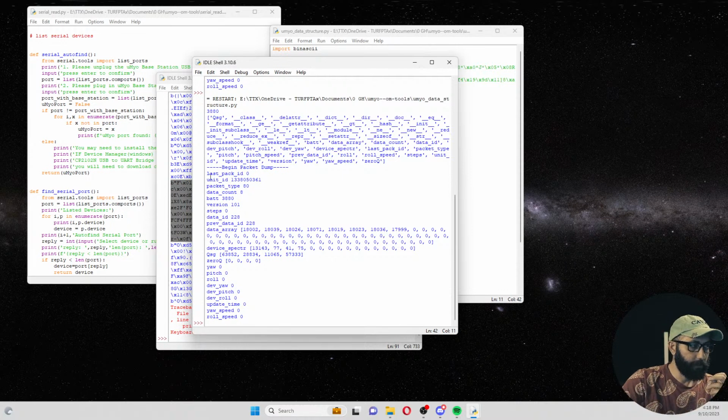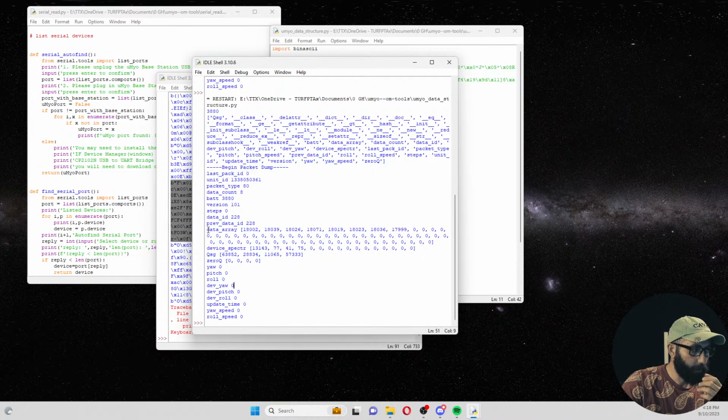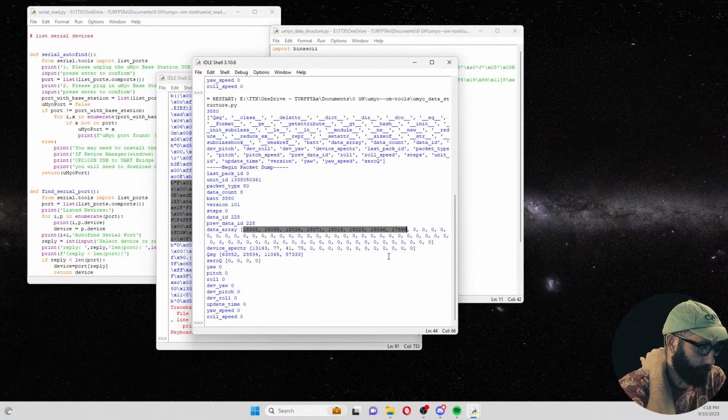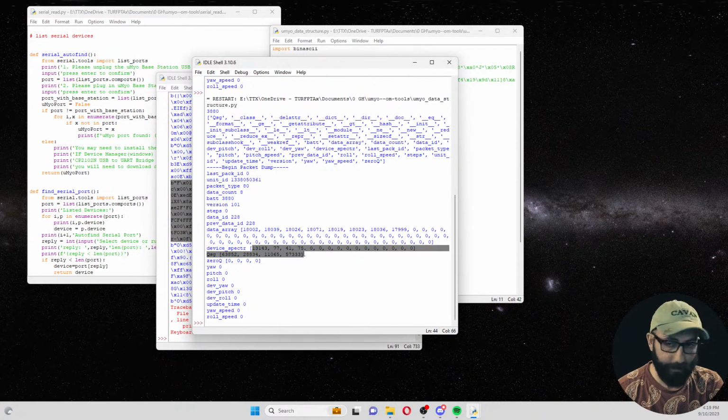So this is what is inside of the packet. Perfect. So we're gonna want these values here, and these will probably be the meat and potatoes for the machine learning side of things. And what's kind of nice is that it looks like we have 8 sequential reads of the sensor, and I believe that's what it is. And this is a built-in analysis of those, which is kind of neat.